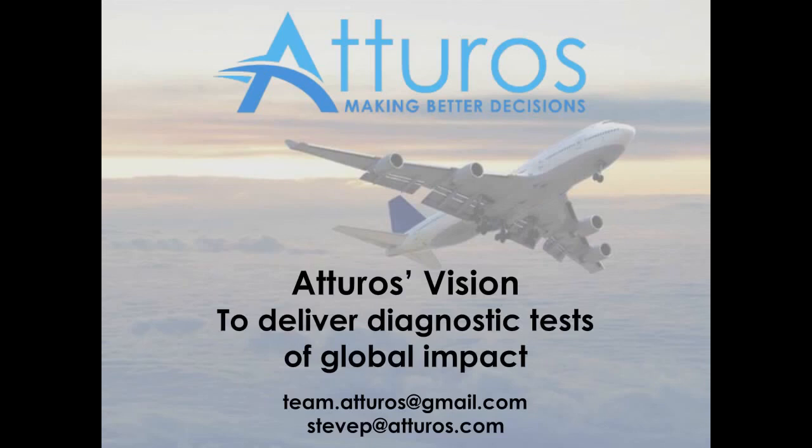That, as with all of these things, when you choose something, it has advantages and limitations. And of course, the biggest limitation with serum is that it requires a blood draw and then subsequent centrifugation, which limits then the point of use of the test. So in this case, the sample that's used for the test has to be taken in a clinic that has access to the ability to prepare serum.